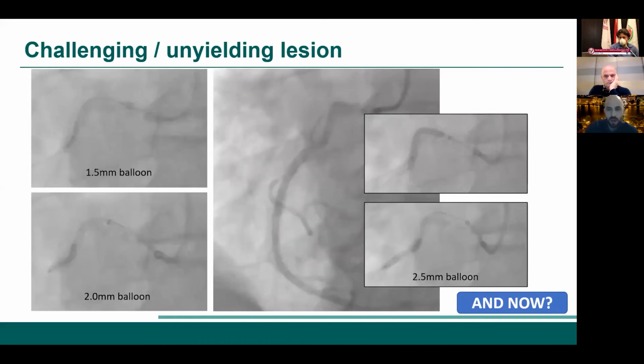But the distal one, you can see classical BEF, balloon expansion failure, or the hourglass phenomenon, however you want to call it, as you are trying to expand the 2.0 balloon. Now, the rota can pass this 90-degree arch. It's not too big of an issue. What you have to be careful about is not to use it at high speed. So use Dynaglide and advance the burr with Dynaglide inside the artery through this 90-degree arch, and only switch to full speed when you are at the vertical section and going downward.